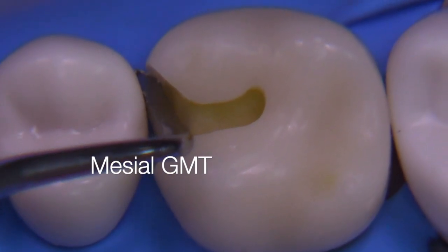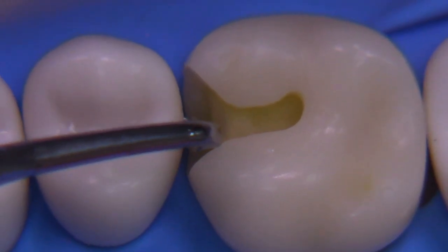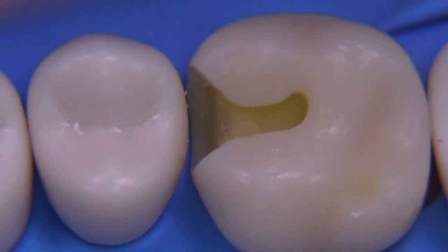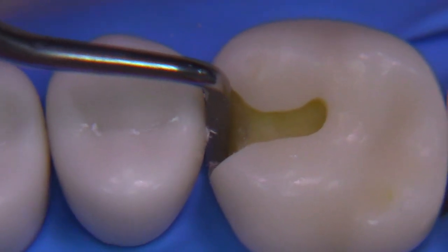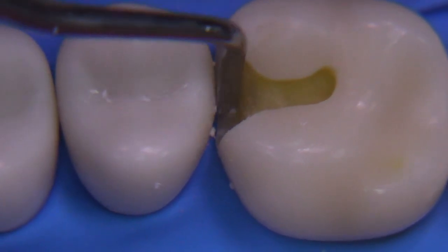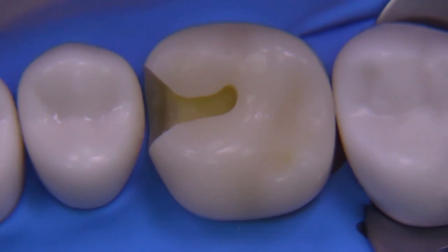I increased the outline forms as well. Here I'm using the gingival margin trimmer to create a little bit of a bevel on the gingival and improve the bond of the adhesive agents to the enamel. You'll notice that the preparation outline is decidedly flared, which would never be allowed for an amalgam but is quite ideal for a composite preparation. Thanks for spending this time with me — it was kind of fun working on these new teeth. Take care.